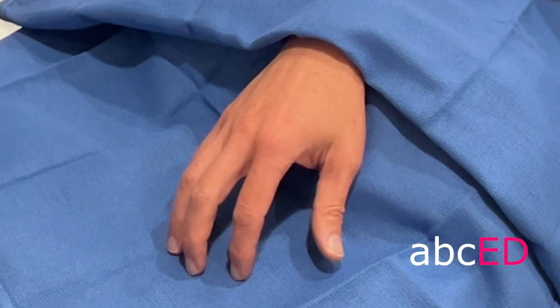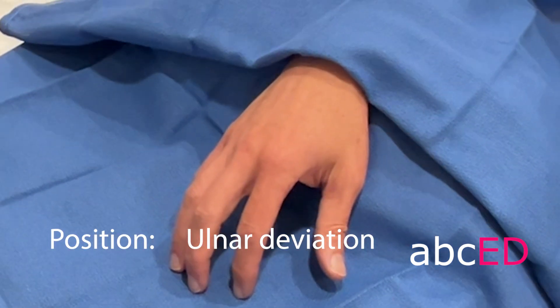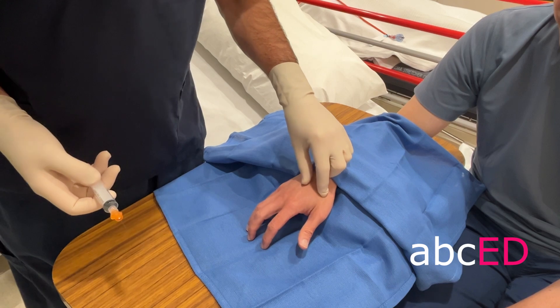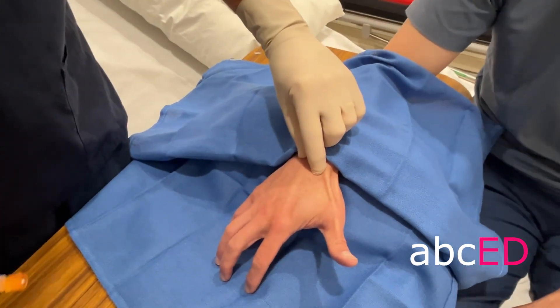We have the patient cleaned and draped, we have the wrist flexed and just slightly ulnar deviated. Get the patient to flex the thumb, identify Lister's tubercle, and we're going to go just distal here.